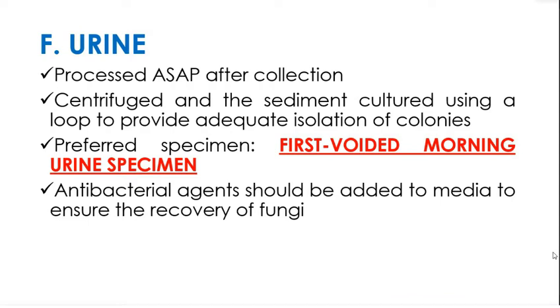It passes through a lot. Bago siya maiihi natin, meron na siyang bacteria. You have your normal flora with it. So you wouldn't want an overgrowth of the bacteria sa urine. Kaya kailangan din natin siya i-process agad-agad. Kaya pag urine ang specimen, best yung first voided morning urine specimen.